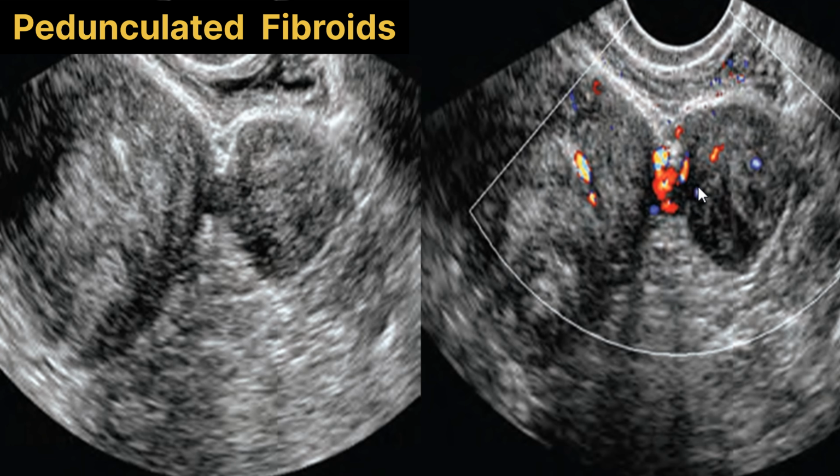Now this is the color Doppler of the same image, and it demonstrates blood flow in the stalk which is connecting the solid mass to the uterus, and it is further confirmation of the mass, which proves the pedunculated fibroid.